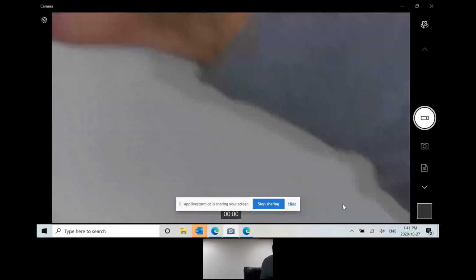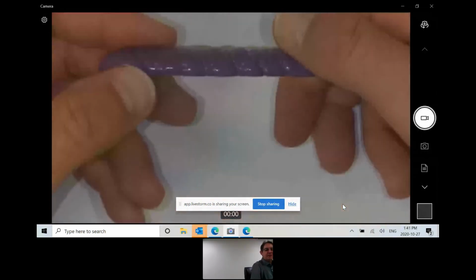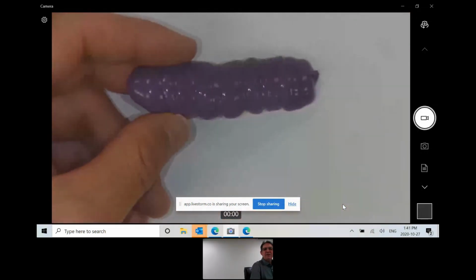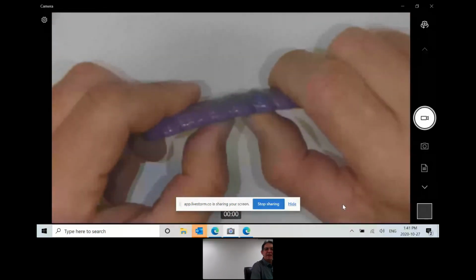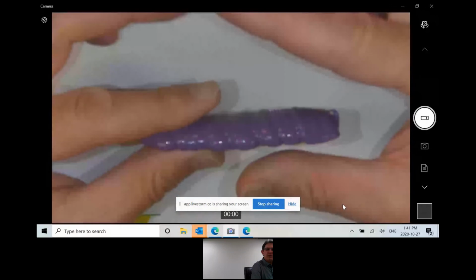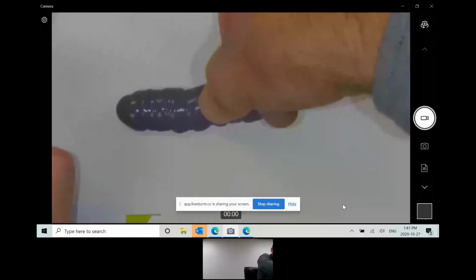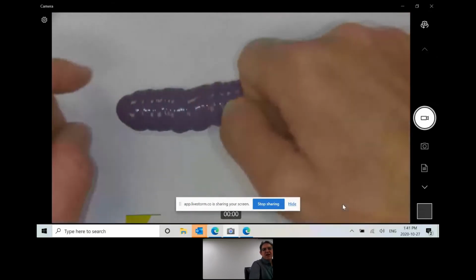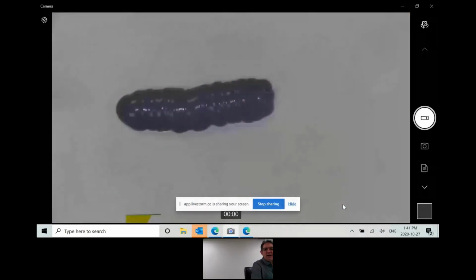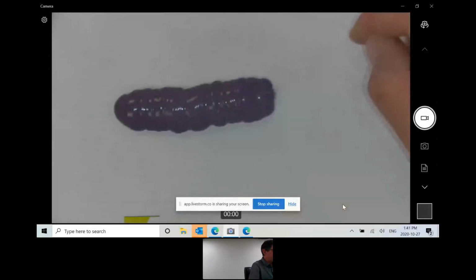And then just to show you the bite registration material, the thing with bite registration materials is when you're testing them for durometer, most people want to take them and bend them. Well, that never happens clinically because remember, you're closing into occlusion. So typically, what I always encourage people to do is see if you can compress the material. Now, because this has got such a high durometer, there's going to be no issues with compression or articulation at the lab.